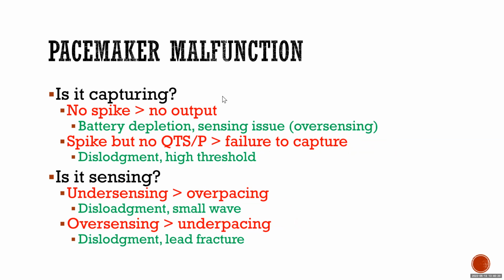So the first is, is it capturing? If you say yes, you're fine. Capture means impedance? No, honestly, don't worry about impedance. Impedance just helps you know the cause of a high pacing threshold. So it's a detail that, if you know, nice. If not, don't worry about it. Sensing and threshold are the important ones. Impedance is an extra parameter that helps you know the details of the cause.